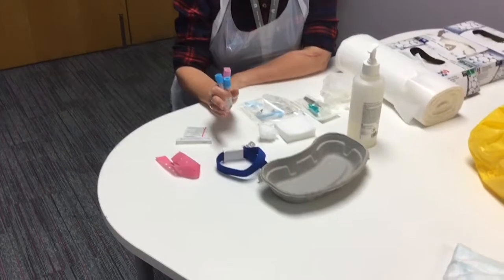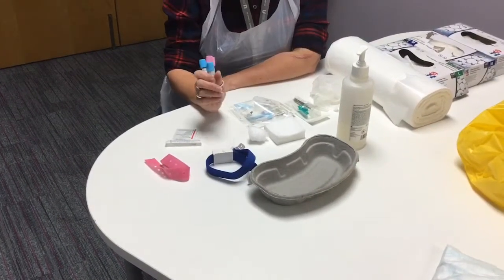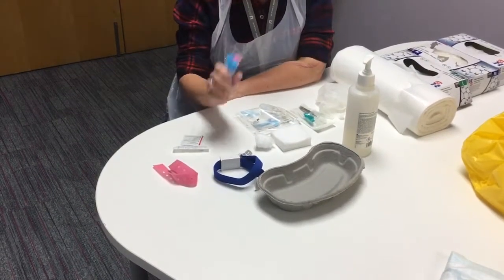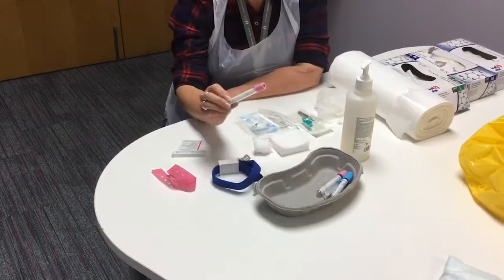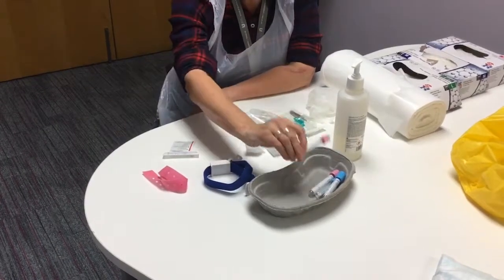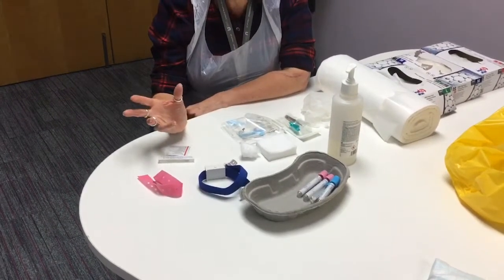Check that the doctor or practitioner hasn't added more blood samples, more tests, more requirements, because it's awful if you have to stab your patient twice. Make sure you've got everything that you need and all the relevant blood bottles. You do need to check the expiry date, check the equipment is always intact with no damage to it, so have a good look at the bottles and make sure they're suitable for use.